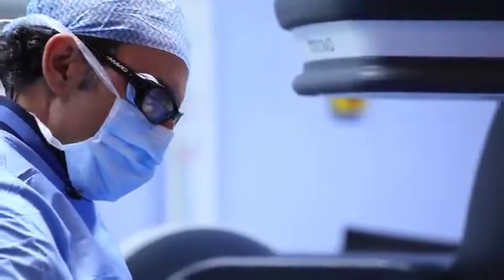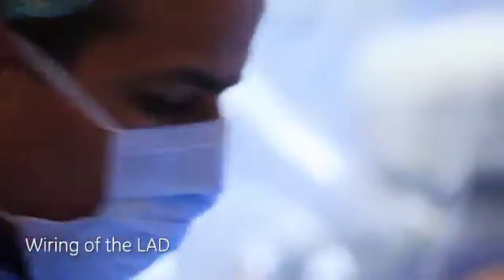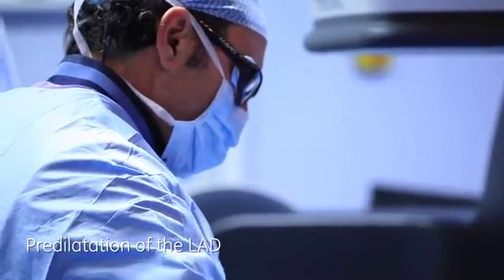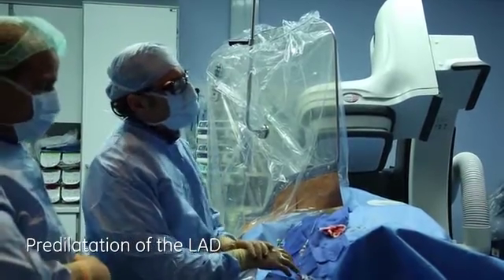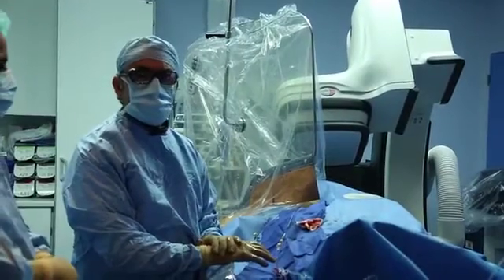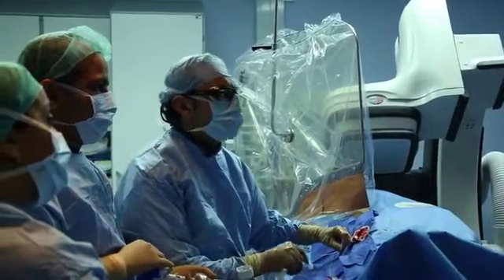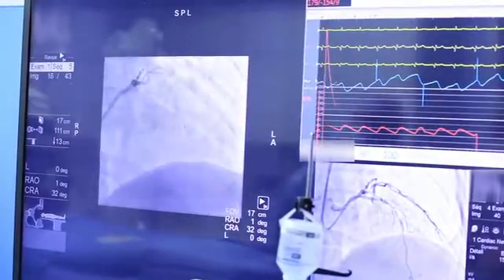I'm wiring the LAD. I'm going to do a predilatation of the LAD with the 2.5 balloon to open the LAD well, which is a very important step for the BVS PCI. Let's take a look with the balloon inside to make a measurement of the LAD.